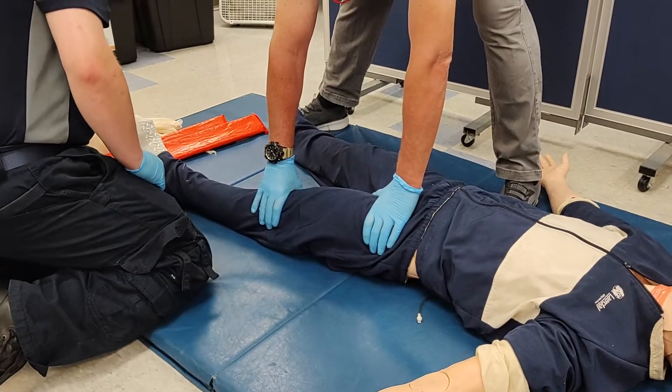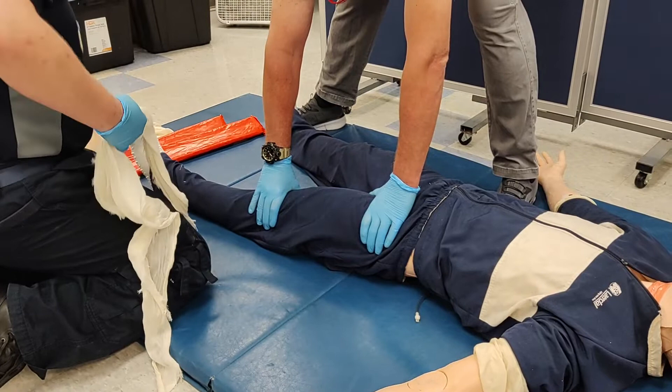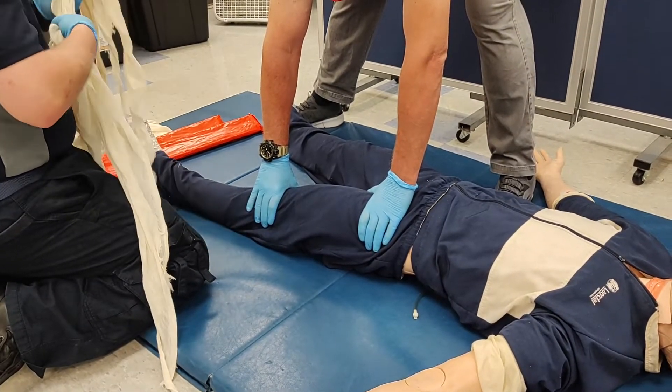If we've identified the need for a long board splint, we'll begin by collecting a long and medium board splint, and at least six cravats.